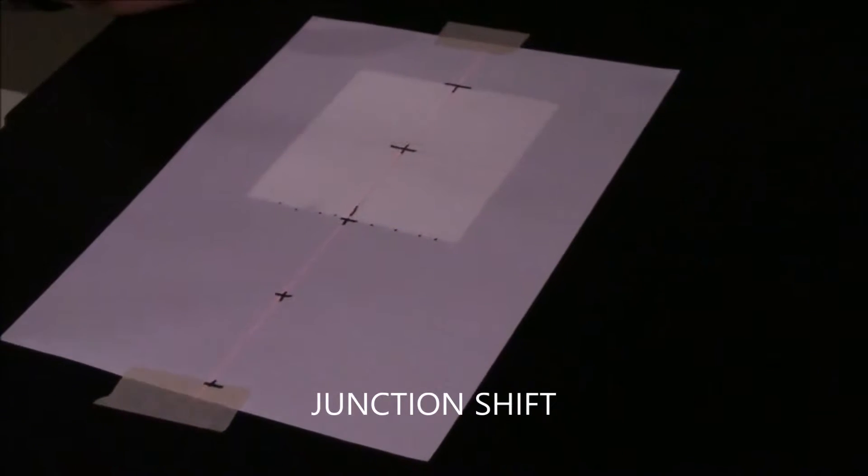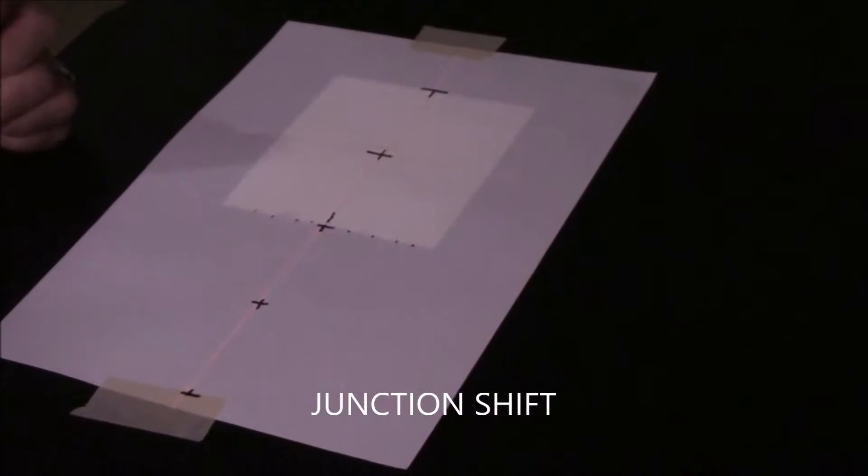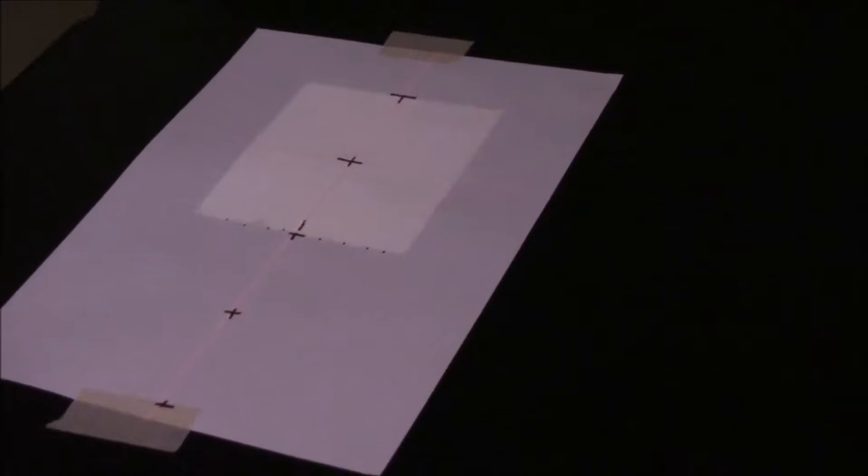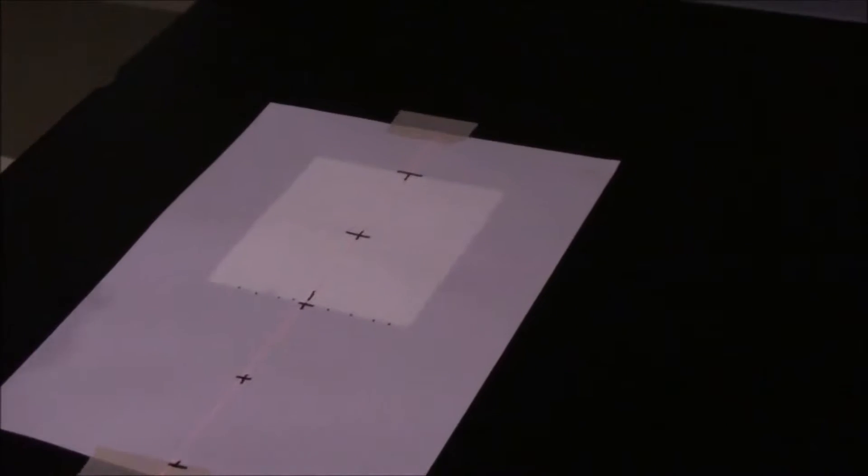I'm going to demonstrate junction shift. We have two 10 by 10 field sizes set with a gap, just a straight gap in between.